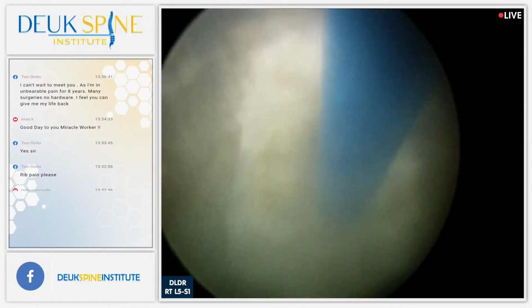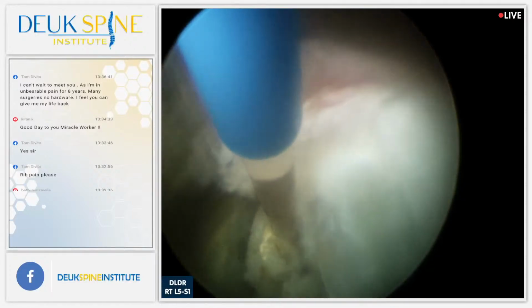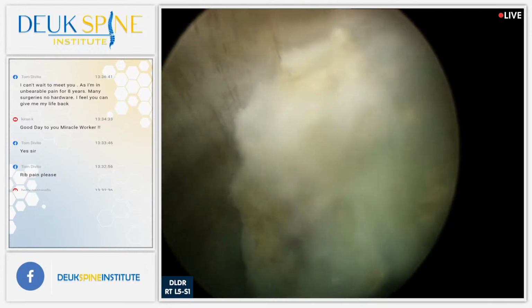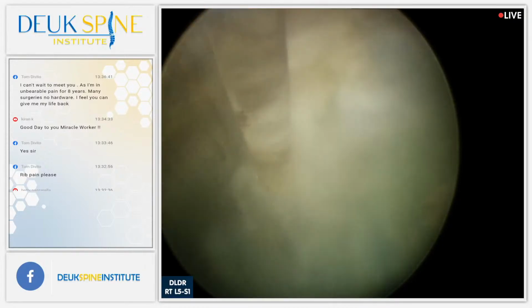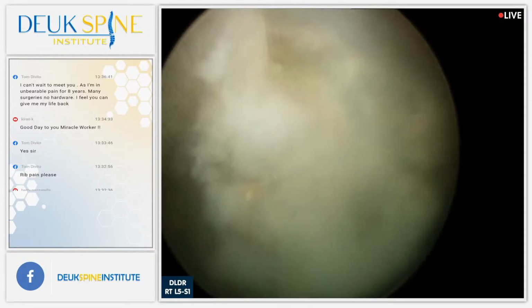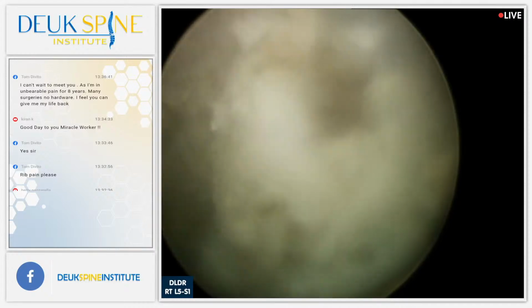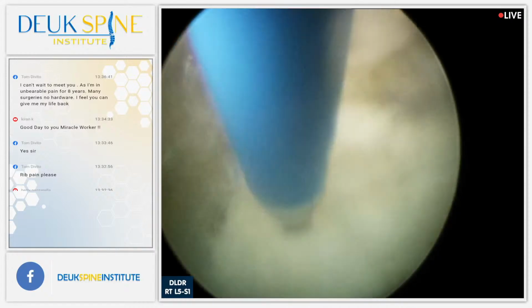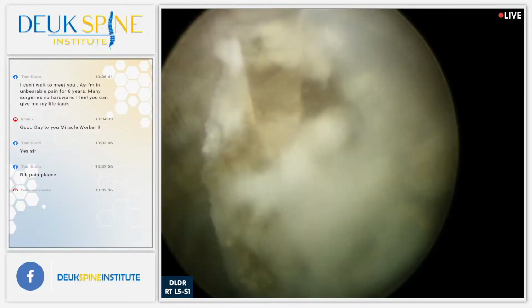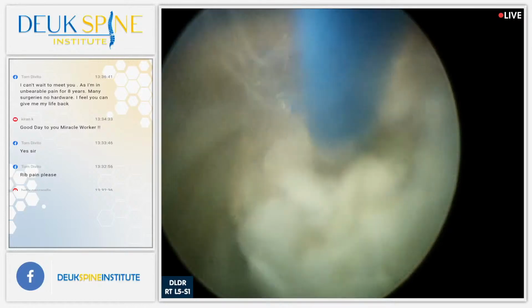Once again, this patient has one bad disc causing pain. He's got facet joints causing pain, which we're going to fix next. And then he's got the piriformis muscles causing pain, which we're going to do last. We're going to break it up into 3 separate streams or videos, even though we're doing it all in the same surgery. The reason for that is we want to show people that they're distinct, separate procedures, even though we're doing them all at the same time.